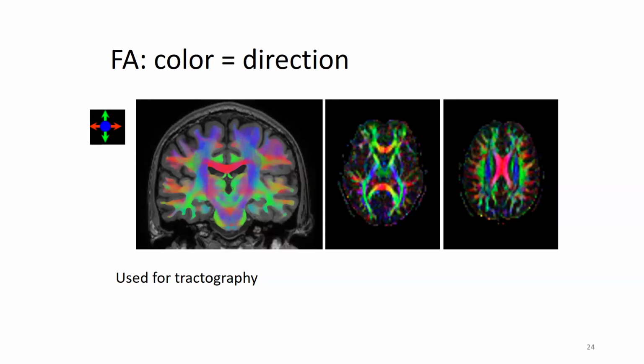When I say from left to right or from right to left, it doesn't mean that it has a certain direction. It's not like the blood flows through a certain vein or goes back through the veins. The diffusion of water doesn't have a direction. It's just about a highway that's present.